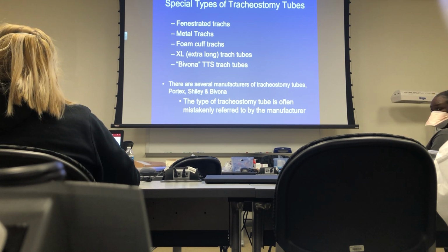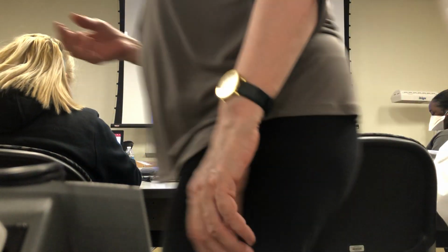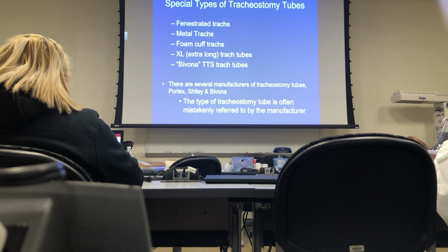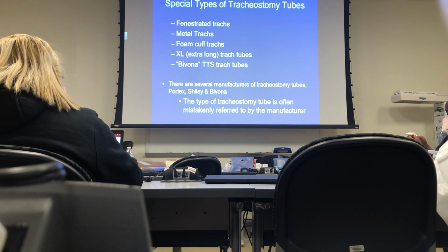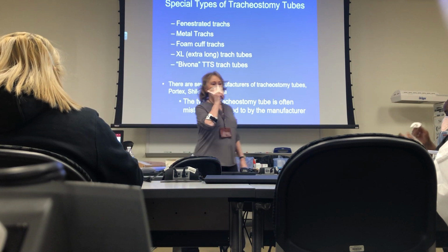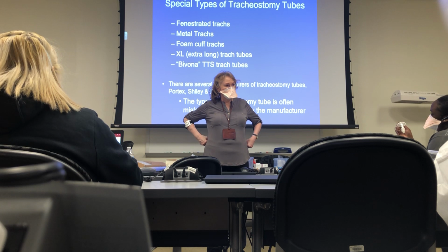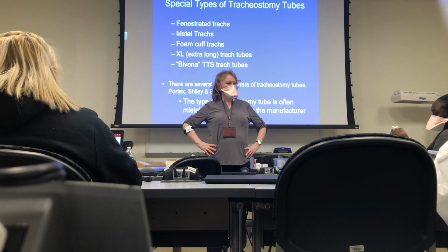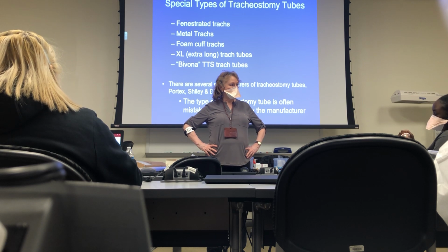You guys can take these two, okay? And show your partner yours if it's not the same. Look all around that trach, and what is the difference in that trach? It's called a fenestrated trach. You see fenestrations. What are fenestrations? Holes, like a fenestrated capillary. There's holes in that one.